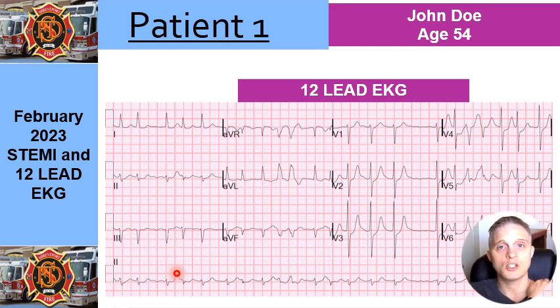And so like we mentioned before, your QRSs are tight, less than 120 milliseconds. And then you go into your T wave. Are they upright or inverted? Well, some are inverted, as we can see over in AVL, and that may just be a PVC right there, but most likely it's an inversion there.